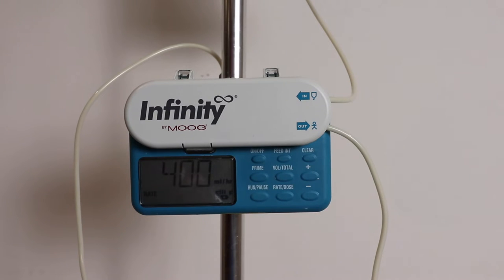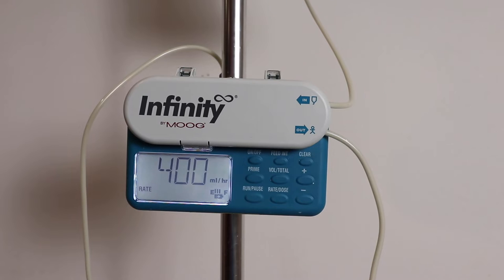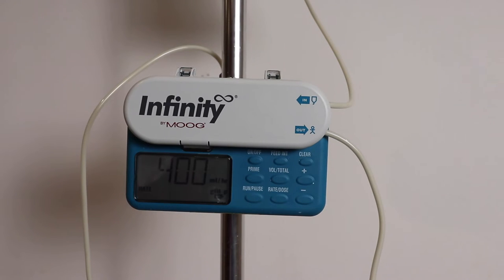After you've opened the new bag, put in your feed, and primed the line, you're ready to feed your child. You have to work with your GI doctor to get the correct rate and dose in order to set up the pump, but I will show you the functionality and how to set up the pump once you have those numbers.